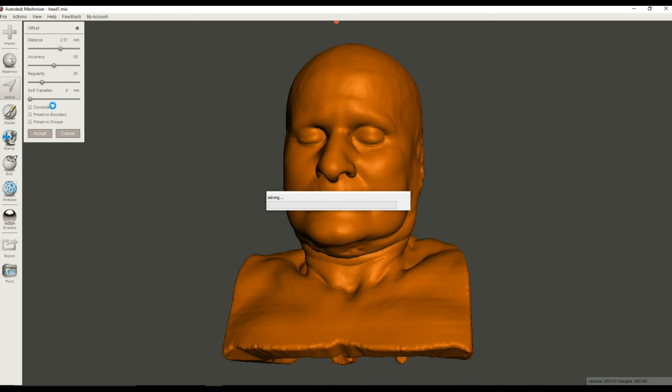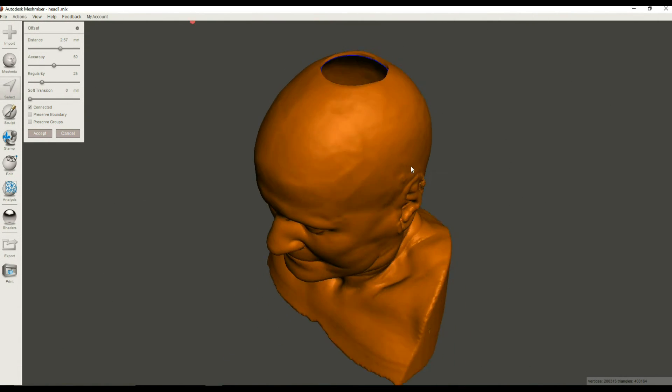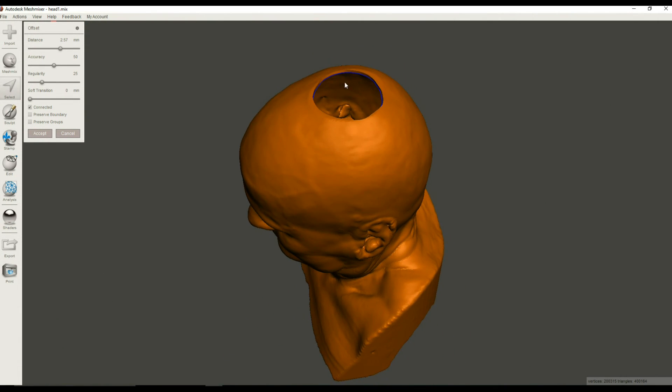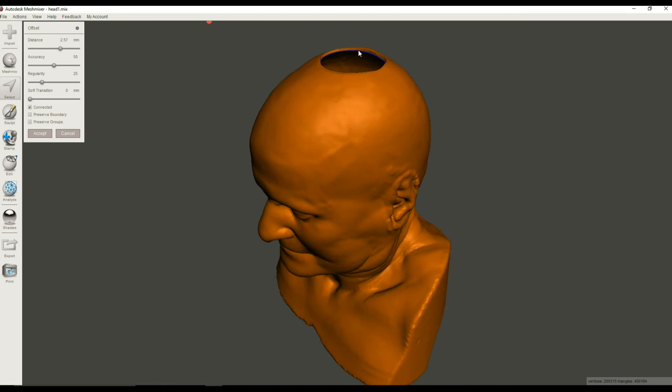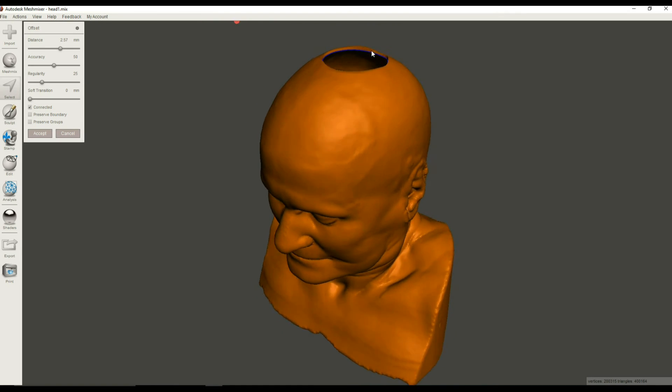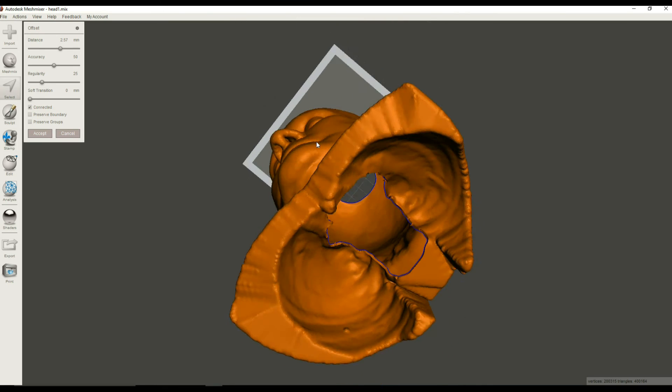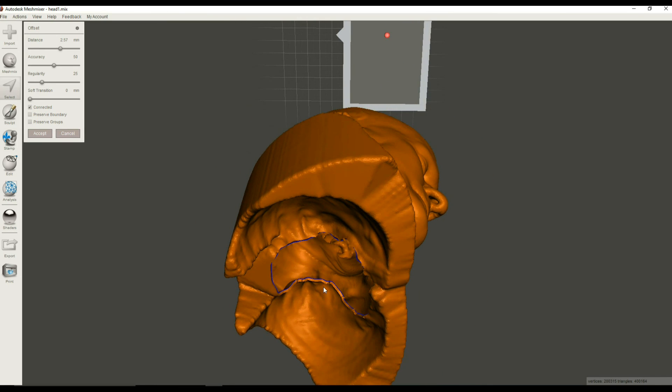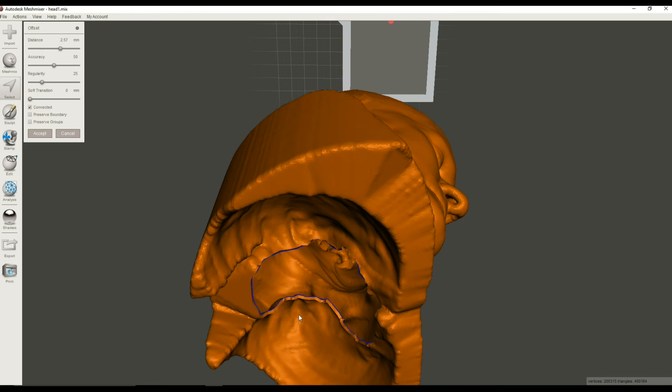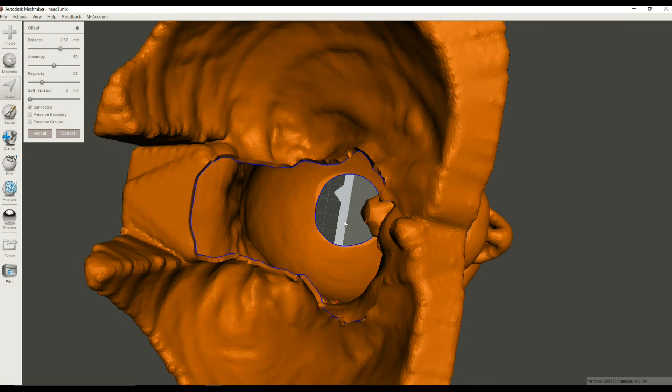So if it doesn't look like it's checked on your version of Mesh Mixer, go ahead and check that. And then it might have to reprocess again. Hopefully this won't take too long. Okay, we're back. That operation took about another minute, and you can see that now the outside and the inside shells are connected. We checked this Connected box here, and when we did that, Mesh Mixer had to reprocess a bit.